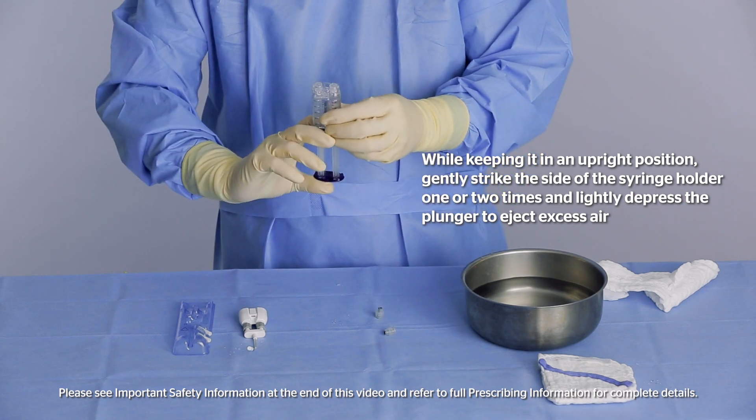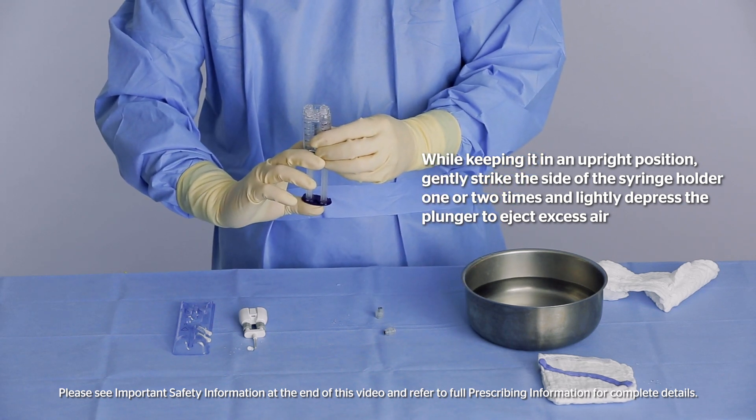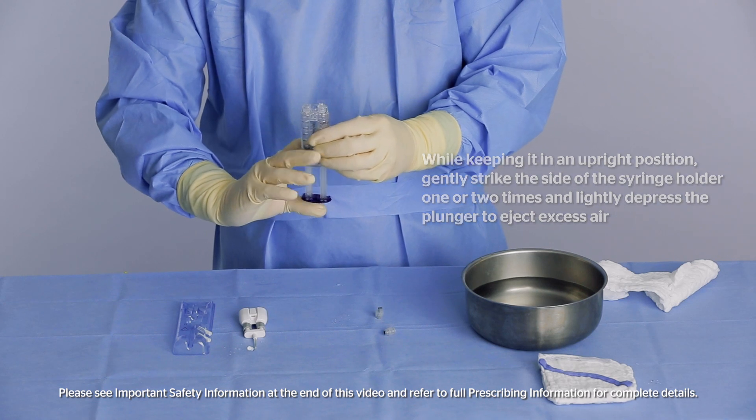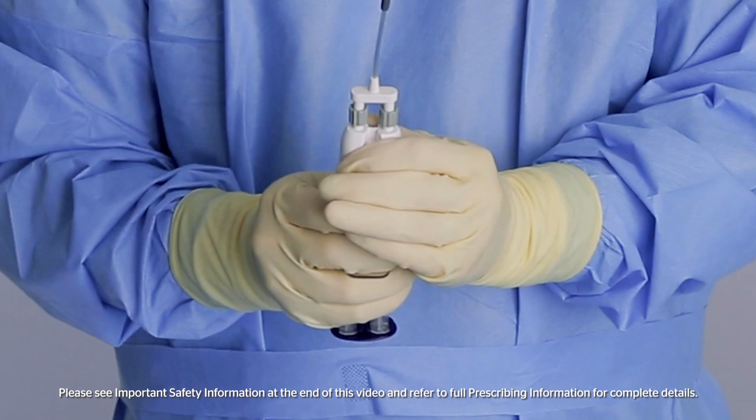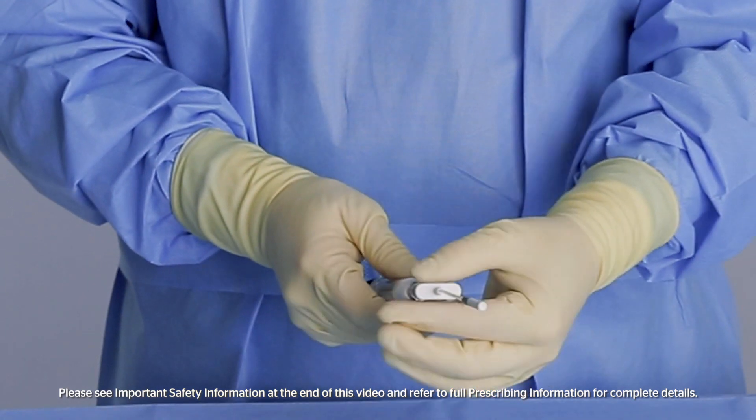Lightly depress the plunger to eject excess air prior to attaching the dual applicator. Attach the VistaSeal dual applicator to the syringe holder. An audible click will indicate the device is ready for use.